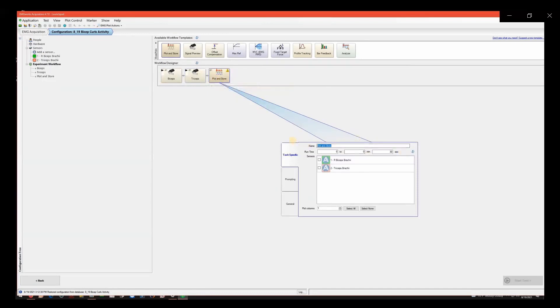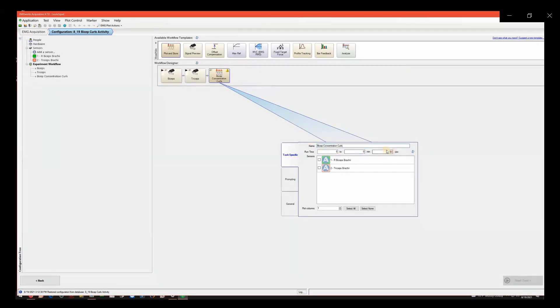Plot and Store shows records of data for specified periods of time. Name the activity, example: biceps concentration curls. Enter Test Runtime for a minute. Select sensors that will be active, examples: one and two. Enter in General Settings the number of trials of data you would like to collect.